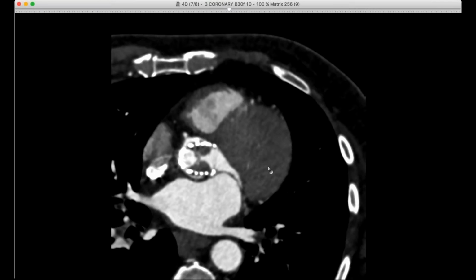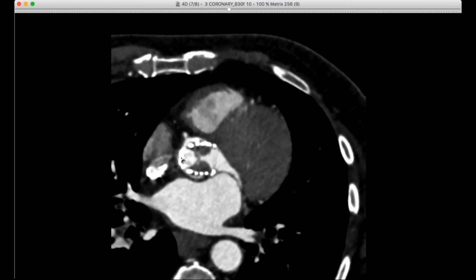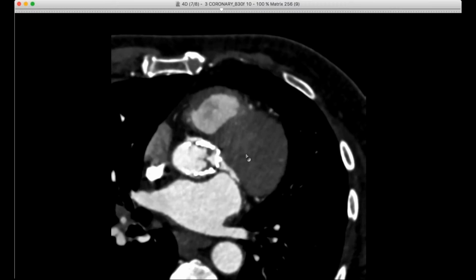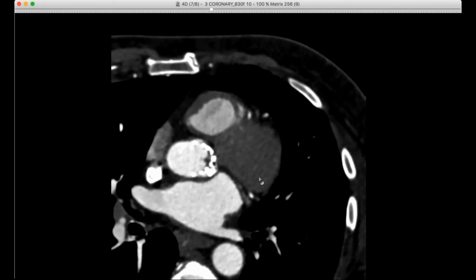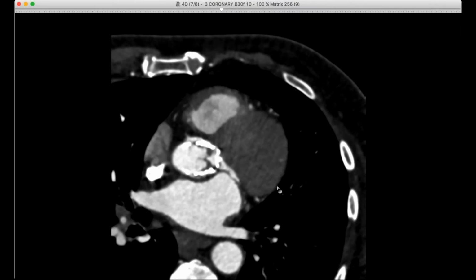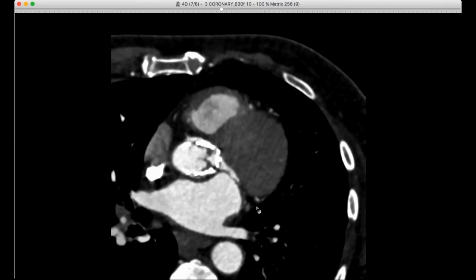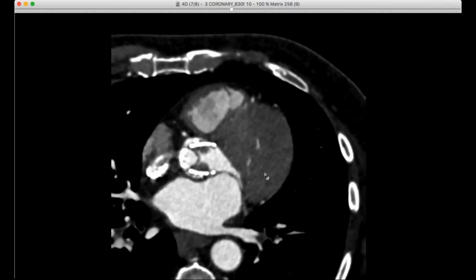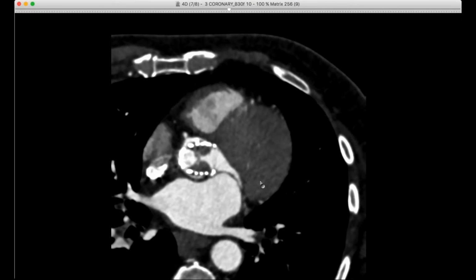This first case is a patient with history of aortic stenosis, of course, who had a transcatheter aortic valve implantation here, and we can see the scaffolding of the Sapien valve here in aortic position. We're doing more and more gated CT of valves as part of the post-TAVI protocol, anytime from 1 to 2 months after they're put in. And we looked for thickening of the leaflets, any evidence of thrombus along the leaflets.